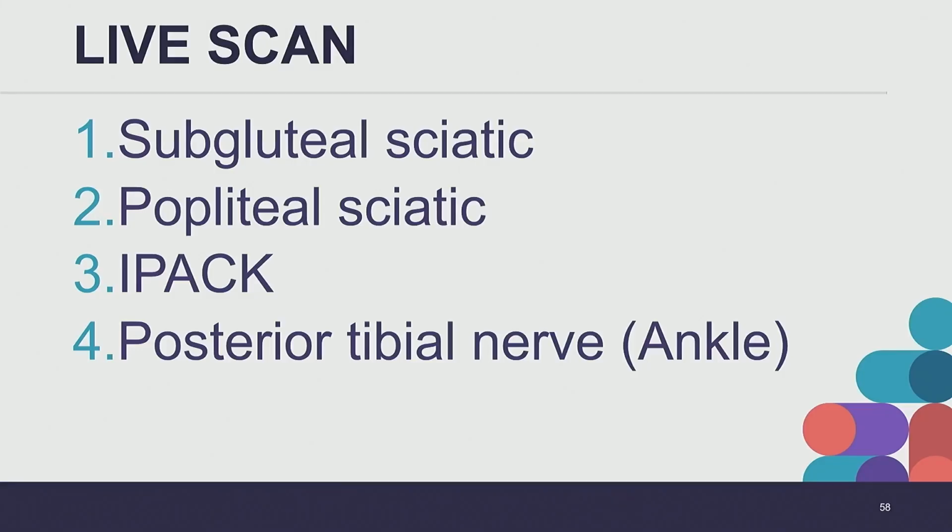That's a great question. Anyone else? Okay, so we're gonna continue to scan distally down that posterior thigh to get the popliteal approach. Oh yeah. So we'll start with the IPAC since we already have the curvy linear probe.